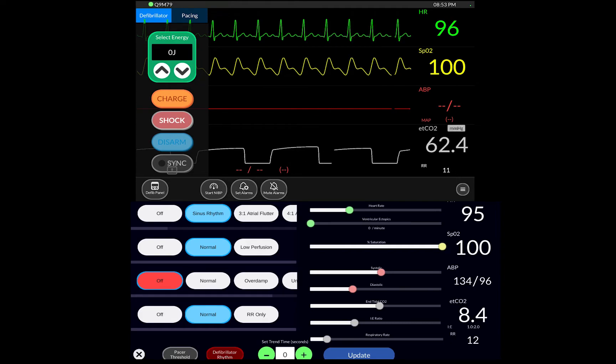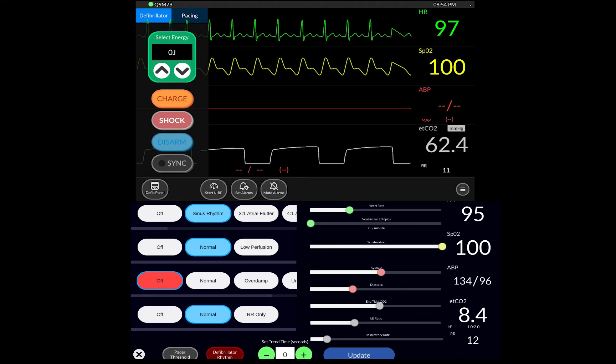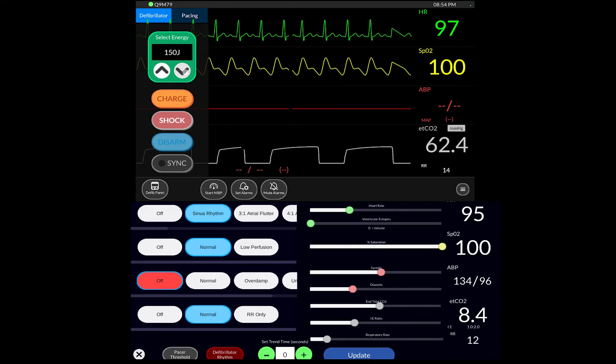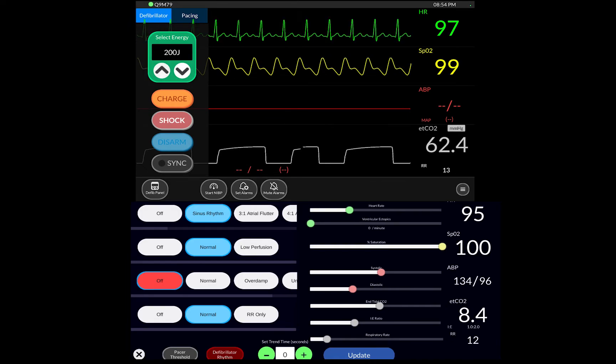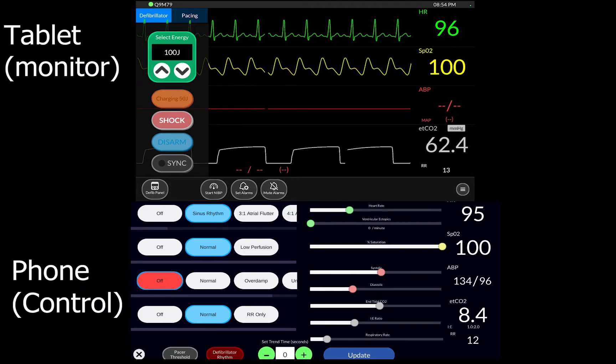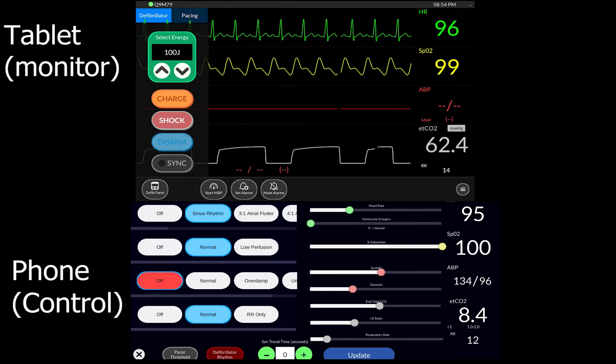So that's always confusing. When it comes to the defibrillator, you can increase your joules here and you can charge and shock. You can just drop the joules just so it's quicker. So I can charge and then shock. That's just how that works.